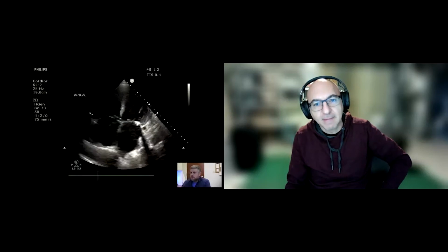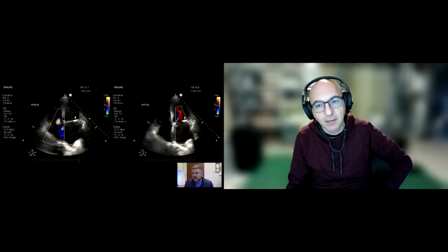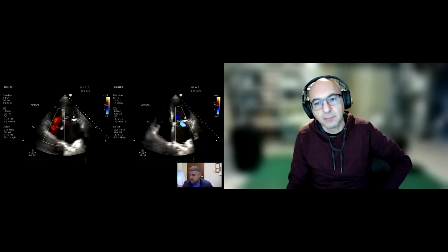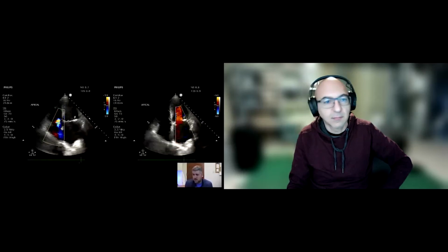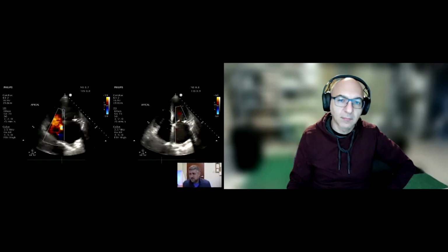All right, so let's go back to this case here. So basically, we're adding a few other things. And Z, feel free to just chime in if you have any comments here. I've got some questions that we'll throw out in this case as we go through this. But just to add a little bit of extra detail, we have our tricuspid view and our mitral view, and we can see that there's a moderate to severe degree of tricuspid regurg. It's a little bit hard to see, but you can definitely see it hits the sidewall and wraps around to the back wall. So that really is getting into my category of moderate to severe TR.